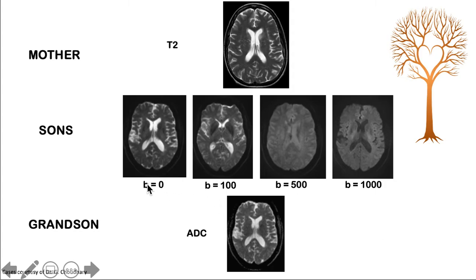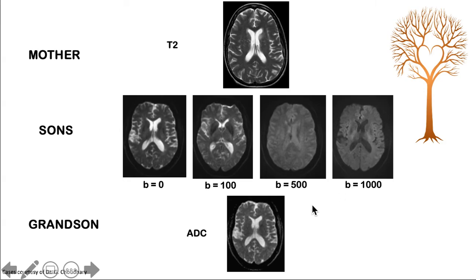Looking at increasing B values, there is one most similar to T2, and that is the B0. As one increases the B value, freely moving water — here inside the ventricles — will reduce its signal, as seen here in the CSF.